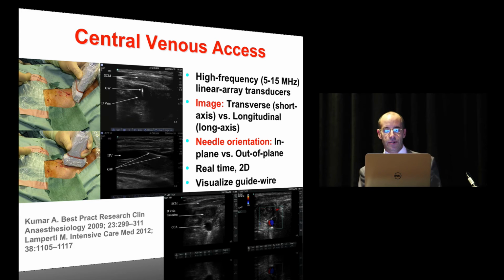The technique, as was described yesterday, I'm not going to go too much into it, but just to stress the fact that it is important that it's not done as a pre-procedure marking, but it's done in real time. You do need to see the needle going in. There's always confusion between your image and your needle orientation. If you talk about in plane, you're able to follow your needle all the way through. Out of plane, you can just see the tip of the needle, like that top image over there.